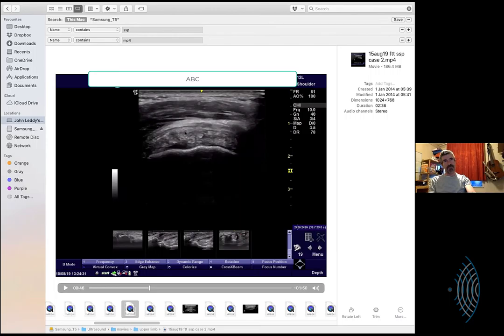Certainly this front part is gone. Where there's a bit of tendon left at the back, I'm not entirely sure. Those are there briefly there. Are there fibers? Do you see that? Yes, I do. Yeah. So wow, you've got intact supraspinatus. Yes. Posterior portion, and there's the infraspinatus.